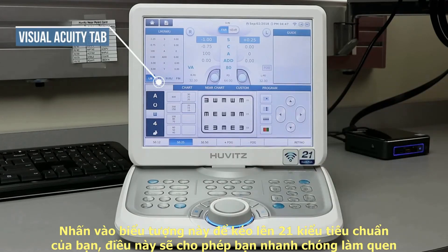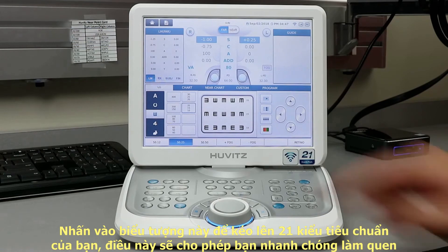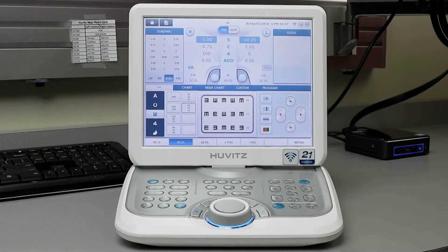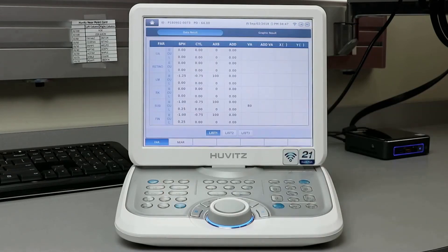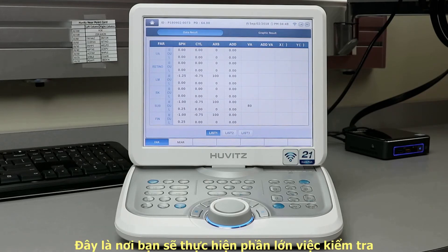When you have finished your refraction, press the finish button. Then press the print button to pull up a readout of your examination. Press print again to send this information to your EMR system via our HDR Mate software.